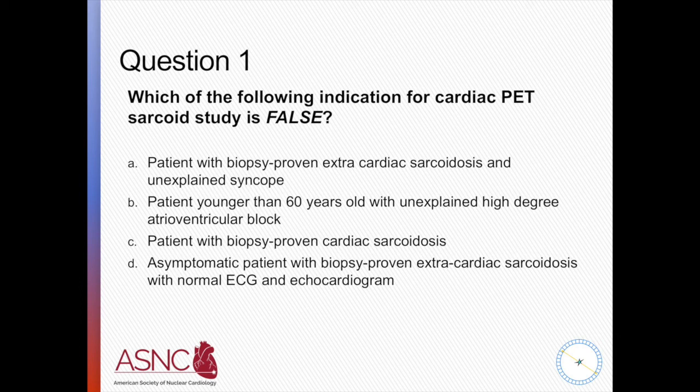And I think in this scenario, PET would be well indicated. And again, if you suspect cardiac sarcoid, a myocardial biopsy may not be the best way to do it. If you want to confirm sarcoid, you go for the extracardiac tissue first, and then a study like this or an MRI could be further proof as opposed to doing that primary biopsy.